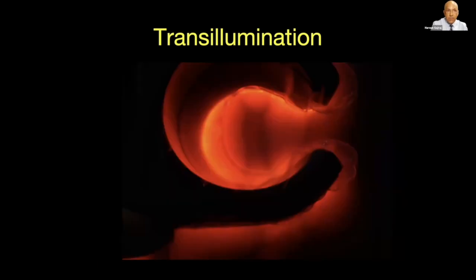And it's a very simple device. I like it. You can hunt for clusters of veins near spider veins. You can see them quite easily, and then you can rotate the vein light to allow the needle to come in.